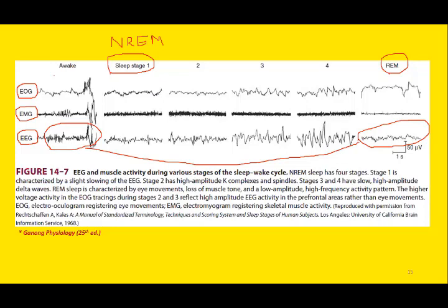This is the beta wave pattern during the REM sleep. So the beta wave pattern is observed not only in the alert awake person, remember, alert awake person, but also in REM sleep. So that is why we call it paradoxical sleep. You can see the pattern is desynchronized. This is irregular and the voltage is much lower. If you compare this wave pattern with the deep sleep, you can see the voltage difference between the two.